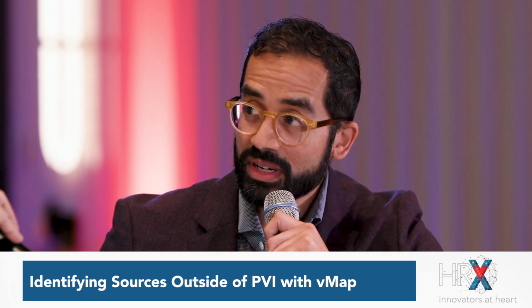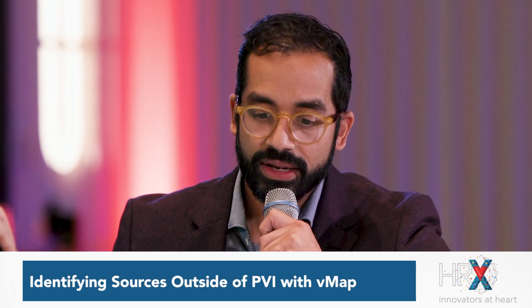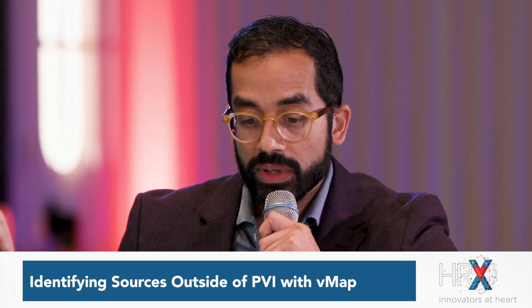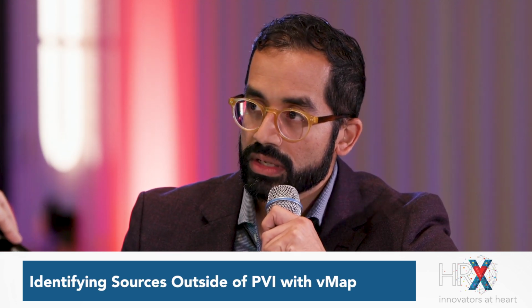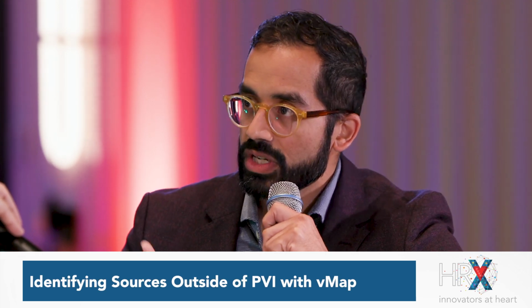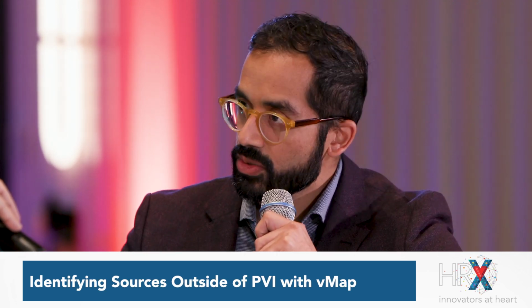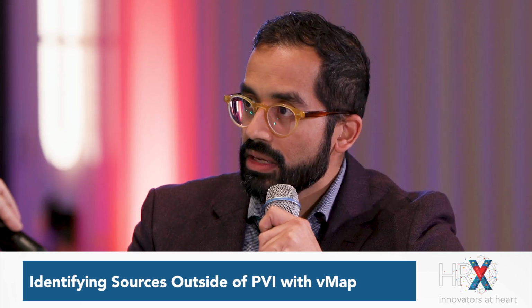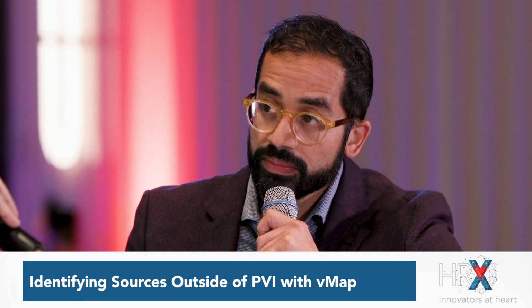Well, thank you so much, Dr. Marrouche. Thank you to Vektor for organizing this event here at HRX. The solution that Vektor is proposing is actually using a 12-lead ECG to help us understand the etiology and drivers behind common arrhythmias. Before the broadcast, we were talking about the primary intent, which was for PVC and VT site of origin.